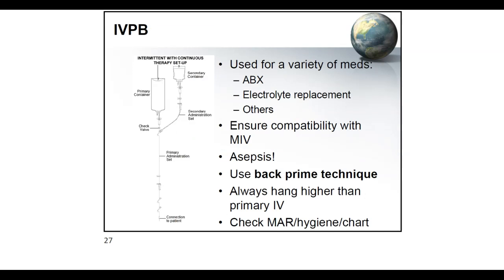All right, next we're going to talk about IV PB or IV piggyback. So IV piggyback, to me, the way I remember it, it is basically kind of like a piggyback. So this IV is riding on the shoulder of this IV bag. So it's piggybacking it, right? So it kind of looks like it if you look at this picture. So anyway, piggyback is basically also known as your secondary infusion.